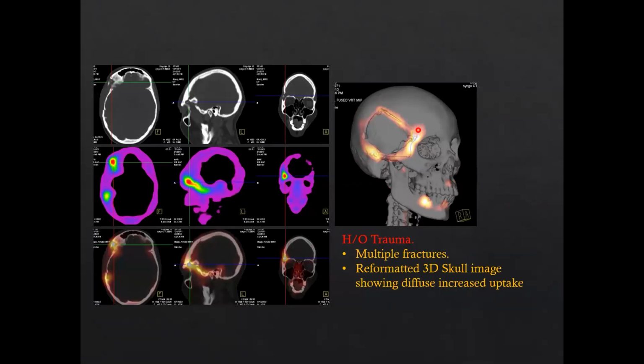And this is a 3D reconstruction in a different color coding, which shows a fracture, and the fracture margins show significant activity. So, it is like an acute or active fracture which shows some sort of healing process, and that is the reason it is showing an uptake. So, it was a diagnosed case.